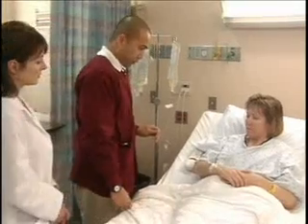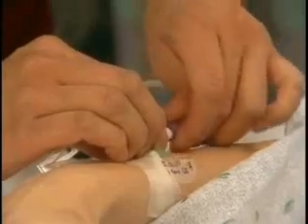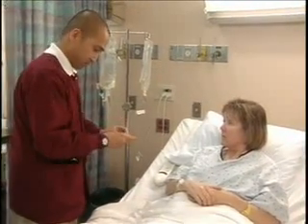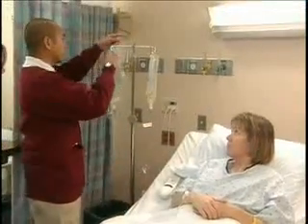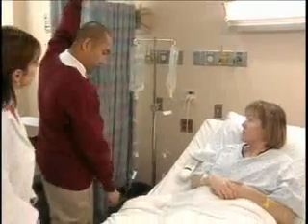Now I'm going to remove the current infusion tubing from the access cap, and I'm going to swab the access cap with an alcohol wipe. And I will insert the new tubing into the access cap.